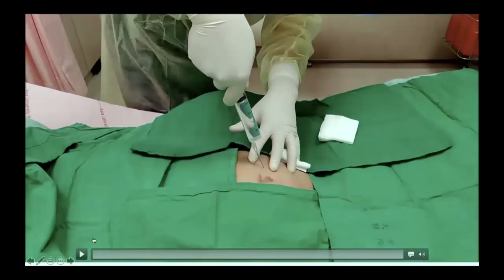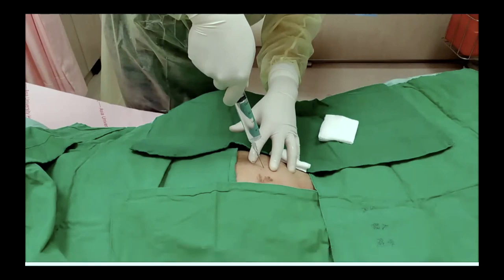This is our video about the procedure. We initially localize the insertion site, put the procedure through the guidewire, and put the peel-away sheath to open it. And at the last, we test the catheter. The procedure takes about 10 to 20 minutes, but the average operation duration was 12 minutes. We can perform it in the outpatient, inpatient or intensive critical care unit. We almost do this routinely and seldom transfer the patient to the operation unit.